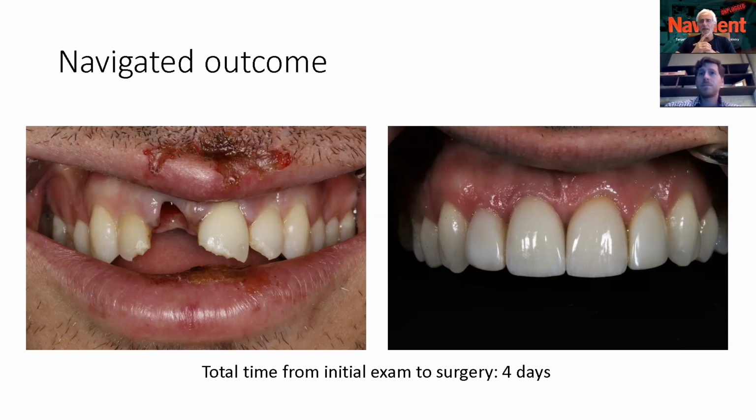One quick question. The avulsion, did that lead to a fracture of the labiocortical plate? It actually was intact. It was still attached to the periosteum. I did feel like when I pushed on it, there was some give, so I believe there was probably a green stick fracture, but the blood supply was still intact and it wasn't highly mobile. By keeping the implant away from that plate and minimizing pressure on it, we're able to hold on to all of that.